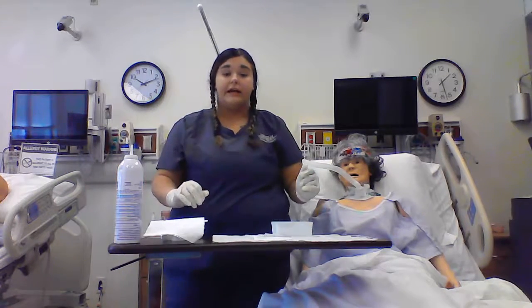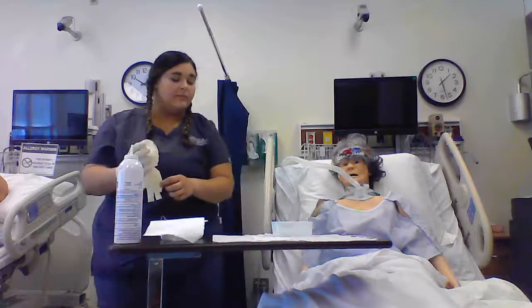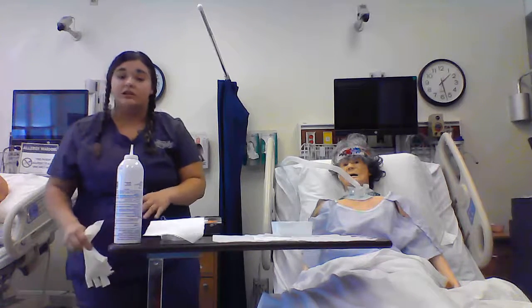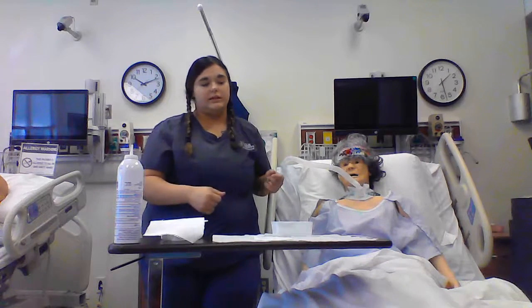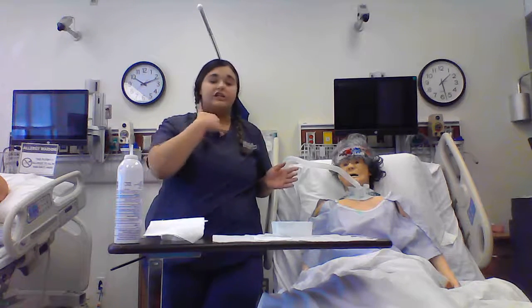I'll clean up my area here, and after I know that my patient is stable and my area is cleaned up, I would then go document how my patient tolerated the procedure, the characteristics of all of her secretions, what color they are, if they were super thick, that she's breathing okay, and that I changed her dressing.